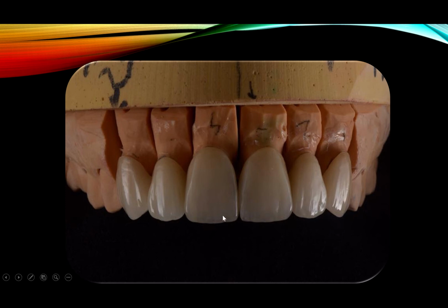So I do my micro layering on the zirconia the same way I do it on lithium disilicate, but you have to be careful grinding the zirconia due to micro cracks and all kinds of stuff. You have to use aqua finishers for grinding. It's better that way to minimize the risk of micro cracks. And then I don't cut back a lot with zirconia. Usually I use zirconia in the posterior zone, premolars and beyond. So you don't do much cutback on zirconia.